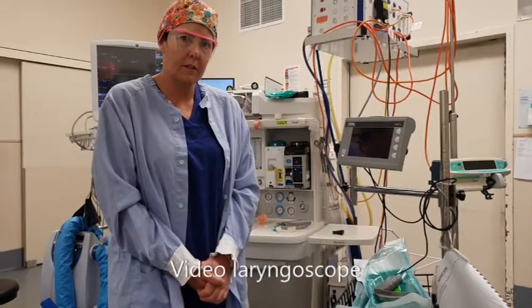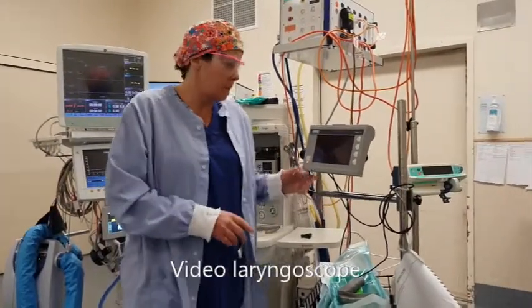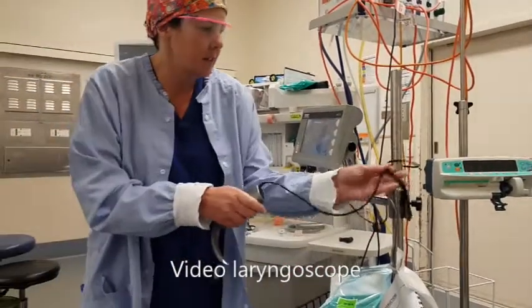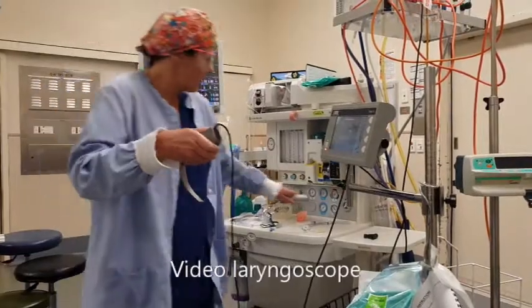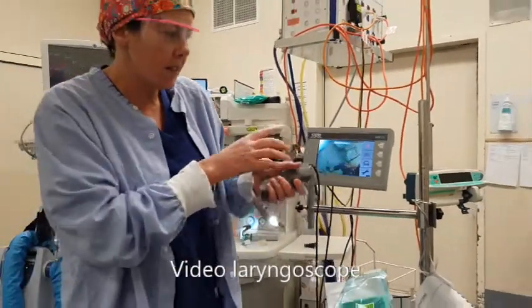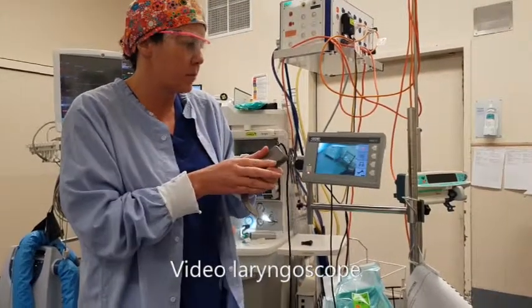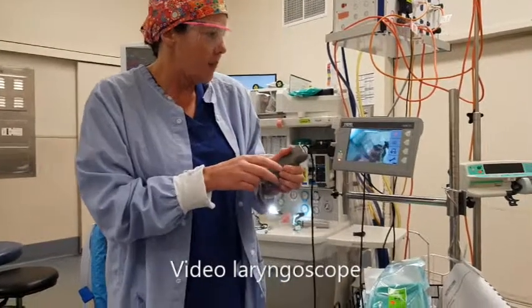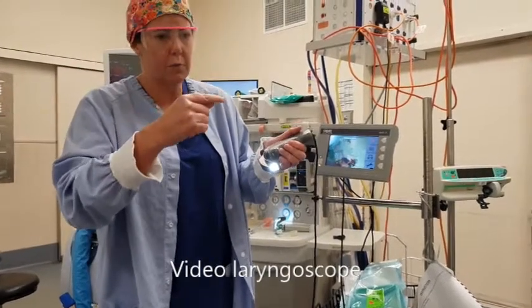What would you do if you had a patient with a difficult airway? We have a number of devices available. The one I find most useful is what we call the C-MAC, which is a type of video laryngoscope. It looks very similar to the standard laryngoscope but gives us a much better view of the patient's airway, and everyone in theatre can see it too — your assistant can see it and help you find positions where you can visualise the vocal cords more easily to place the breathing tube.